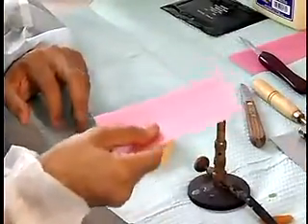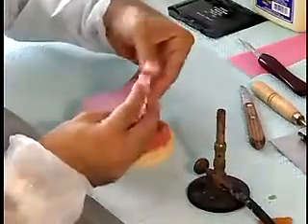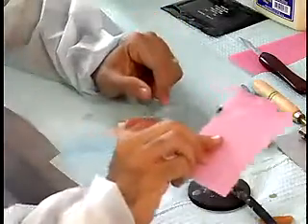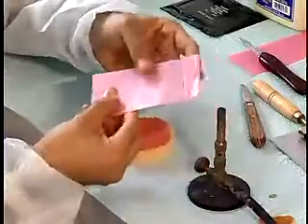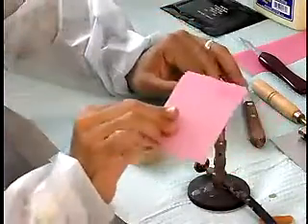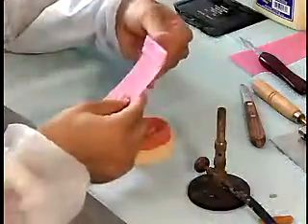Uniformly soften a sheet of hard pink base plate wax. Flame the wax in a Bunsen burner flame slowly by passing the wax quickly through the flame many times. When the wax is thoroughly softened, fold the wax.